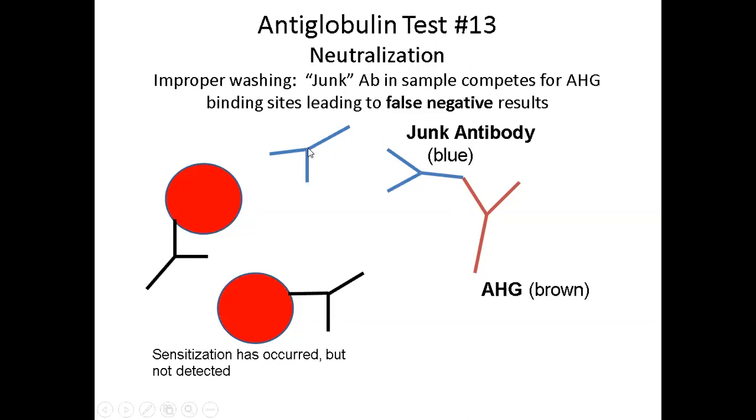Okay, this is some IgG molecule, but you notice it's not affixed, it's not coating any red cells. So this is basically a junk antibody. Okay, so if we don't wash properly with saline and have this get thrown out with the wash, it's going to remain in the tube.